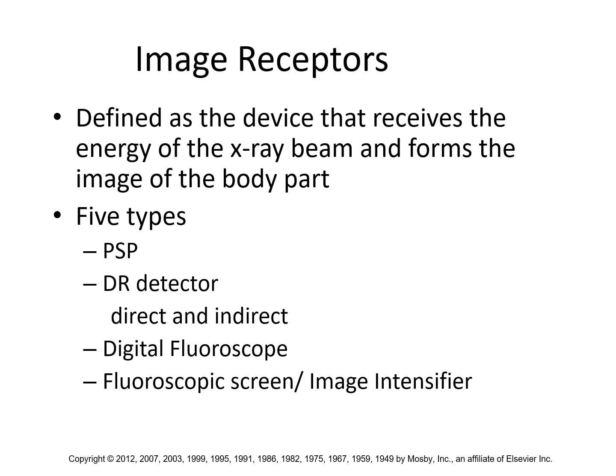Okay. As the pixels get smaller and smaller and we get better and better graphics and larger picture matrices, the resolution improves and the stack of blocks looks more and more like an Italian plumber or a chest radiograph, right?